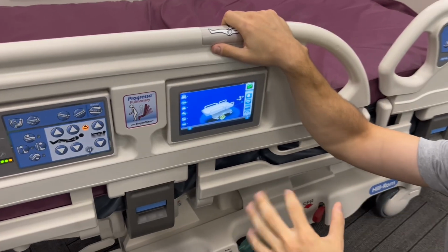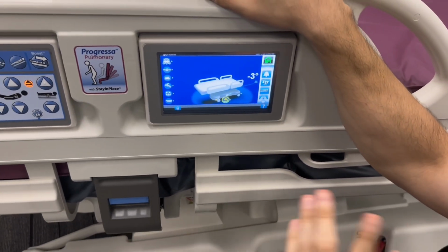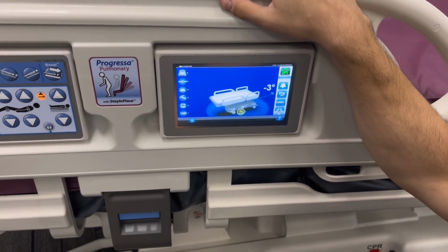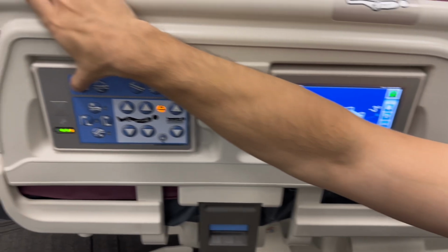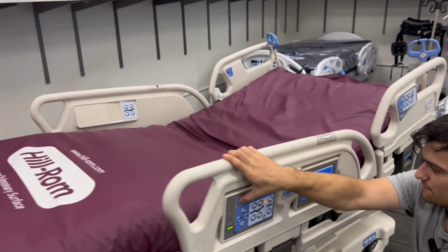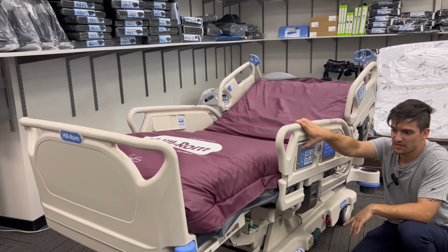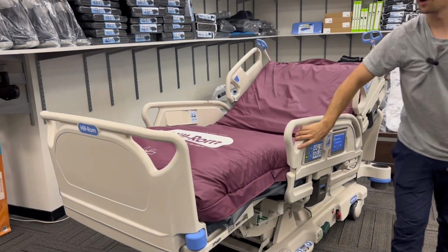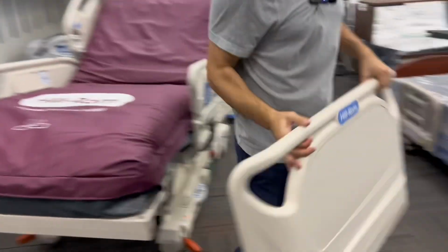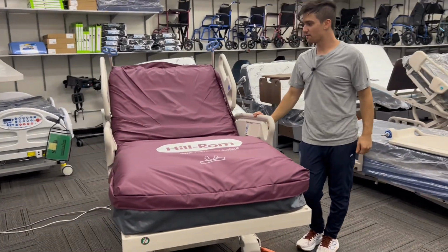So now we're going to go over arguably the most impressive function of the Progressa bed, that they call chair egress, which is going to allow you to go into a seated position and stand from this bed frame. The first thing we're going to do is begin by hitting the button at the top left here. So this is going to begin the chair egress function. One of the things to note, when you're starting this function, you do want to lift your footboard off. We're going to continue holding that button, let the bed go through its motions.